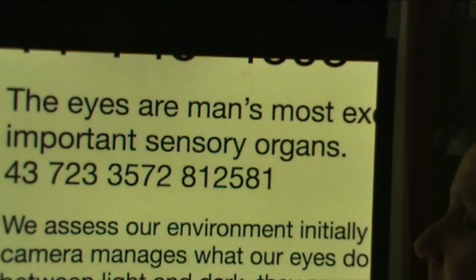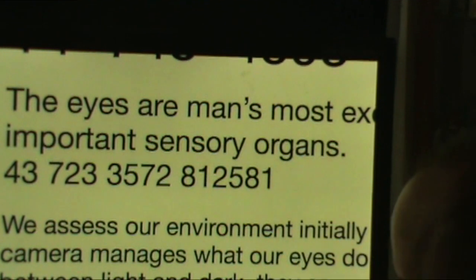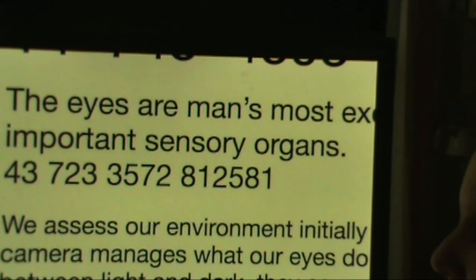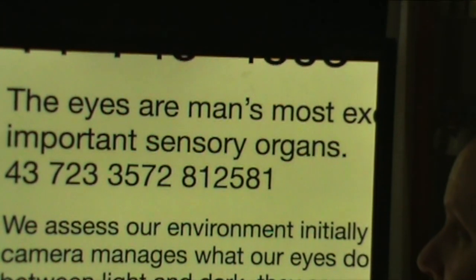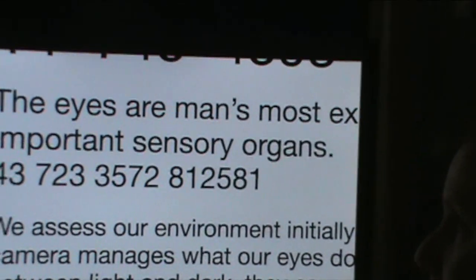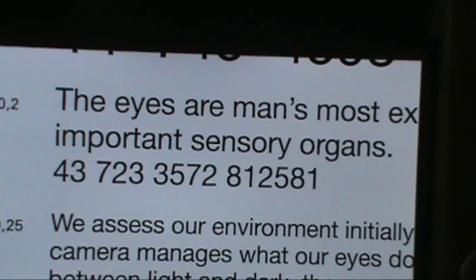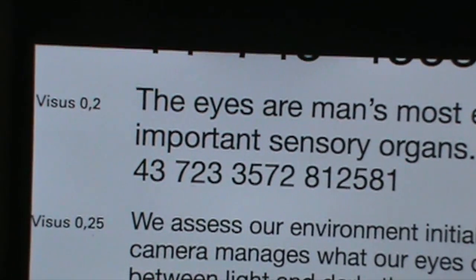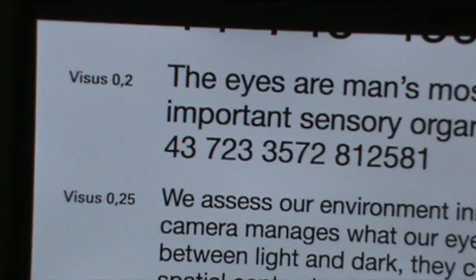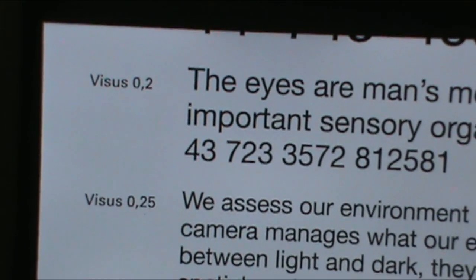But let's say we want to enhance the color, enhance the print, because maybe we need a little bit more vibrancy. Our eyes don't see this as well. Let's change it so that we can actually get a little bit more vibrant screen. What I've done is I press the center button here, and this shows us now that we're looking at black print on a white background, and it's enhanced. So now we have a very sharp, very vivid image.